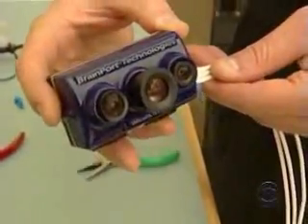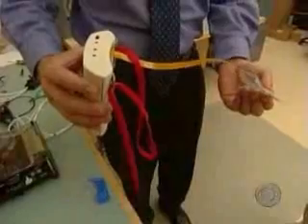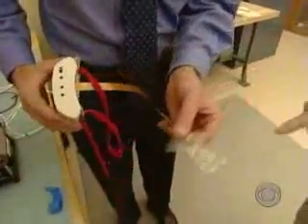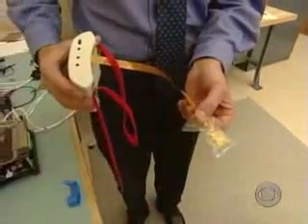Yes, their tongues. It swaps tiny cameras for eyes and transforms the images into electrical impulses that are felt on the tongue. It's as if it's drawing on the tongue the still image, and so if you capture the images fast enough, paint them fast enough, it's like a video display. Instead of being on a screen, now it's on your tongue. You know, when you're a kid, you would draw on your back and you try to guess what it is.